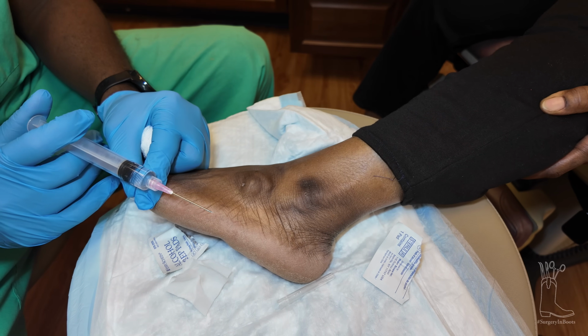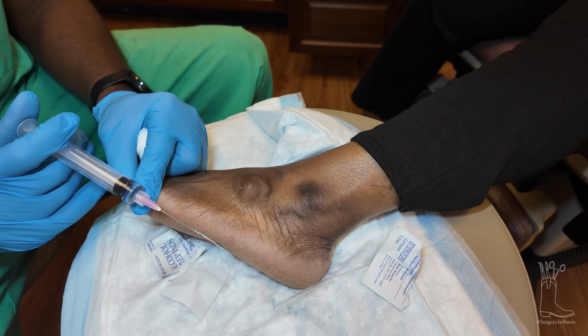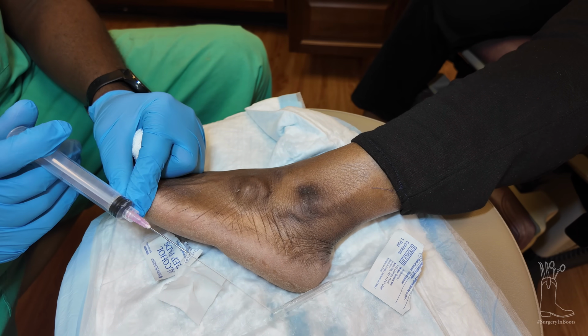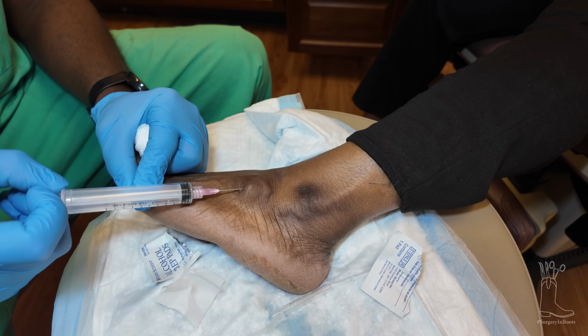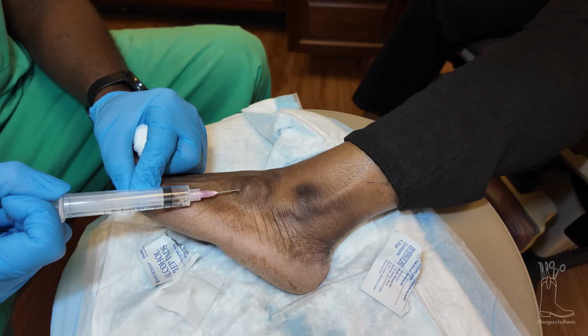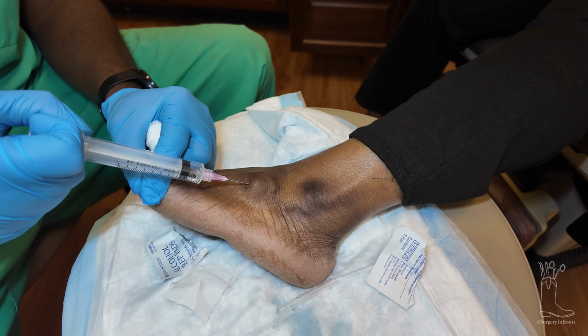So you'll see the differences if you do this. It's just lidocaine. Okay. So we're gonna get rid of that. 1, 2, 3. You shouldn't feel that. I did though. I don't feel you jabbing now. Good. A little bit.